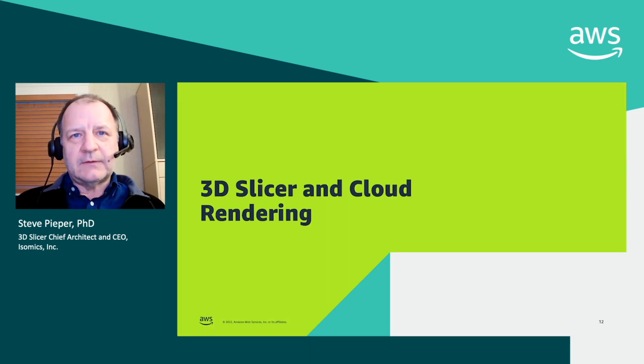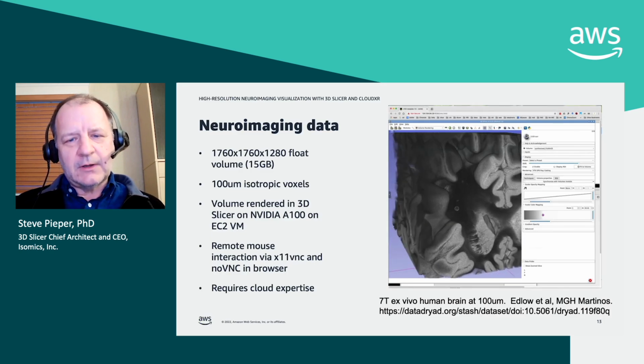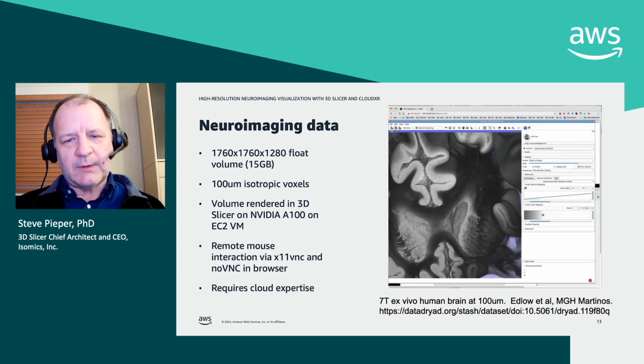And most of that is the traditional, you plug a wire into a monitor and you render with a video cable, the video card. And what I want to talk about now is some of our experiments in cloud rendering and use of cloud computing. So the first example I want to talk about is a very large data set and some work that I did a couple years ago to experiment with cloud rendering.